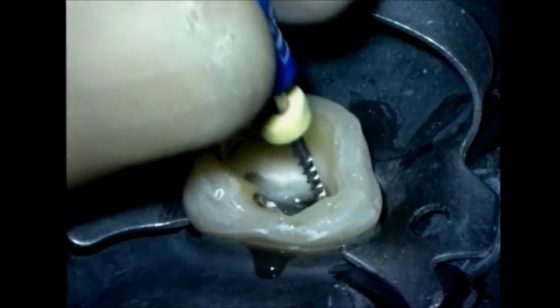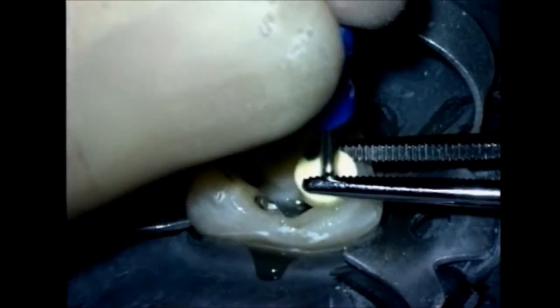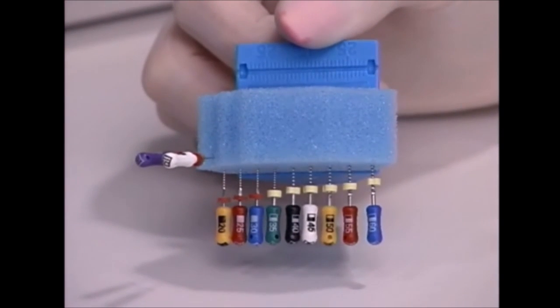The 60 will usually be within about 3, 4, or 5 millimeters of length. A quick way to check your shape is to have the assistants show you the rubber stops and look at the relationship from one stop to the other.